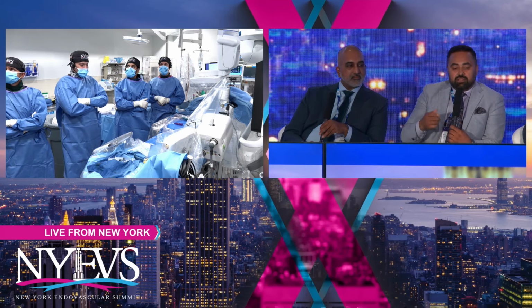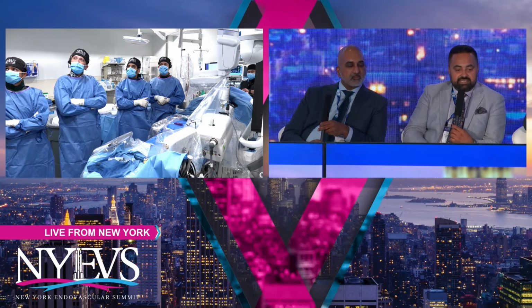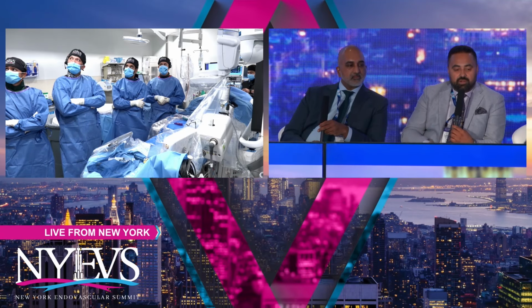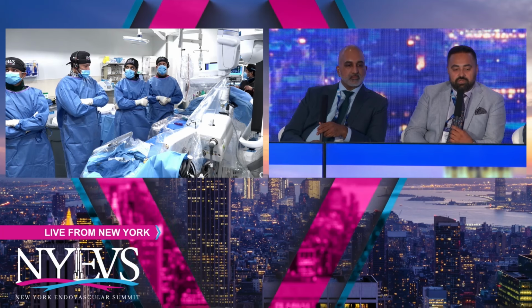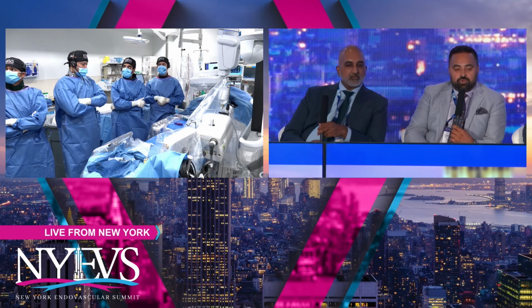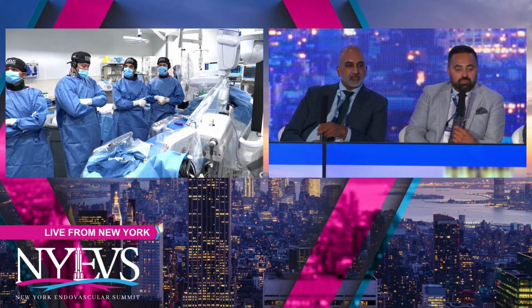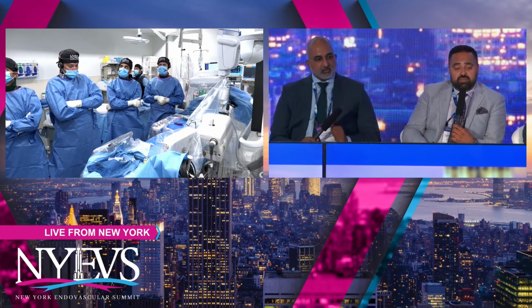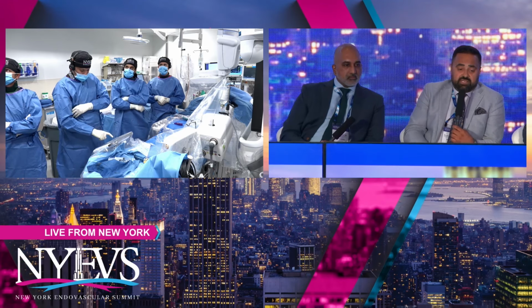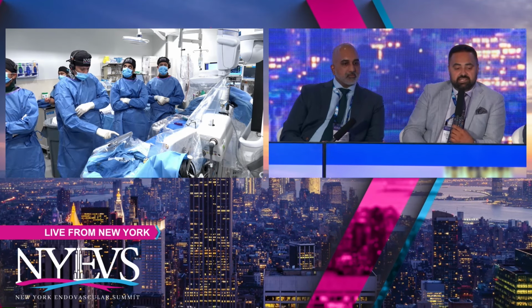But the good thing I think this shows in your cap that you showed above the stents is that you're going to have to do something to that proximal SFA, because that's going to be a recurrent problem. And whatever you do today, if we don't aggressively treat that SFA ostial origin with something, including maybe atherectomy, it's going to be a problem, and you may need to rely on that. But I agree with Jay. If your wire went easily through those full metal jacket areas, then sometimes I'll consider some aspiration first. But, you know, no data to that.